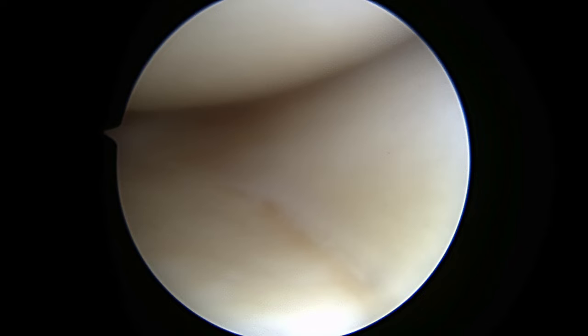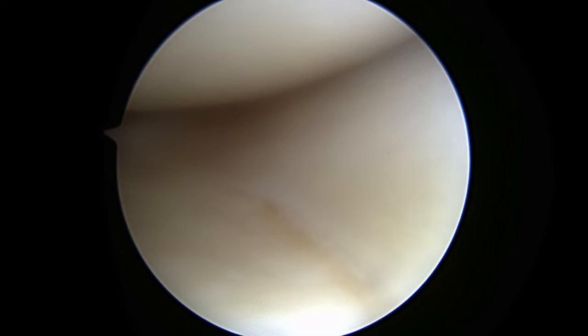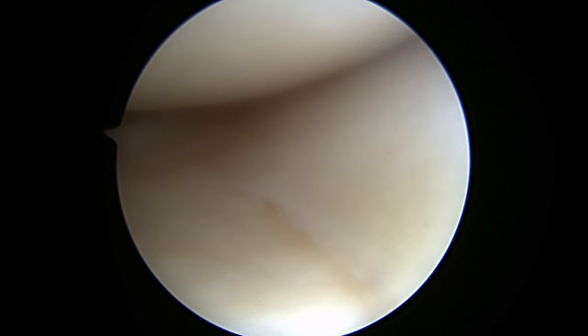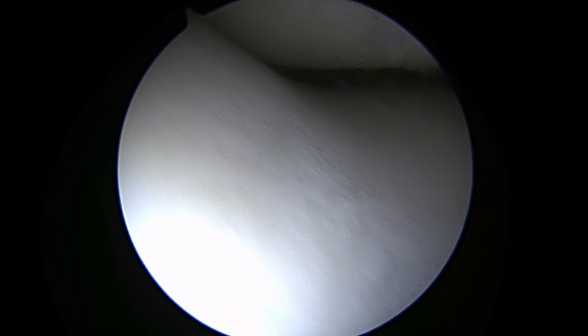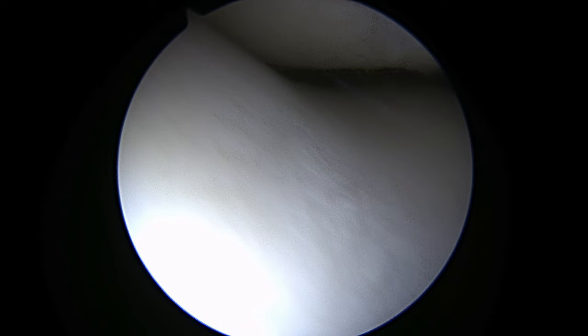A diagnostic knee arthroscopy and arthroscopic debridement are carried out using two inferior portals. The extensive synovitis in the superior gutter, suprapatellar pouch, and inferior patellar space is debrided.